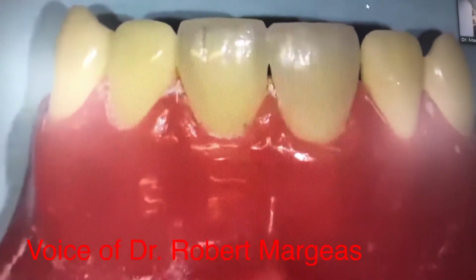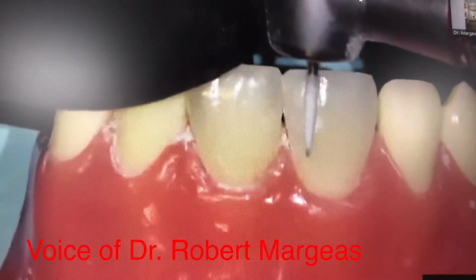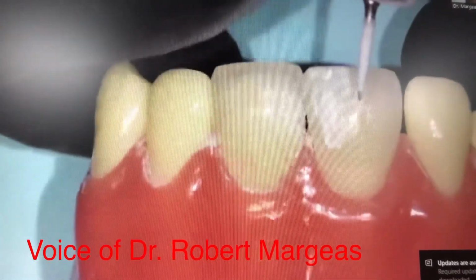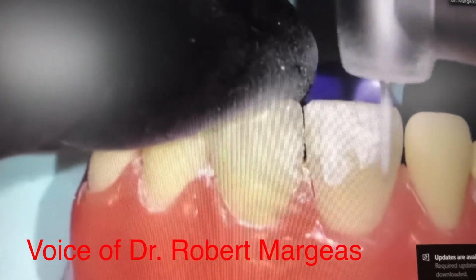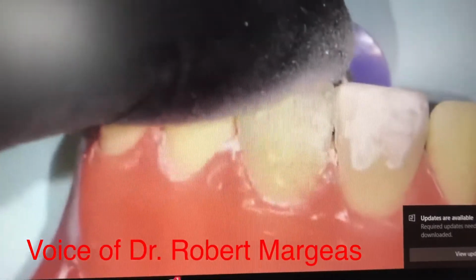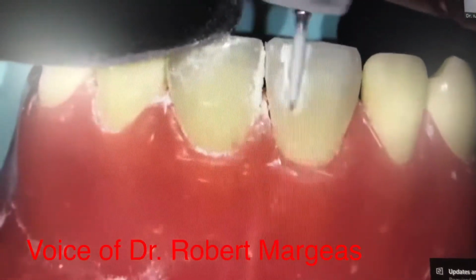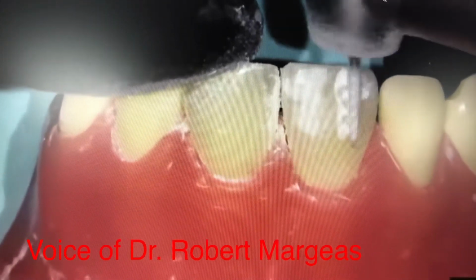So I'm going to come here and take my diamond burr and go a little bit deeper. Usually the mesial depression is a little bit taller than the distal. Like that. And I'm going back and forth on low speed. As I get to the edge, I'll use a swinging motion like a pendulum.